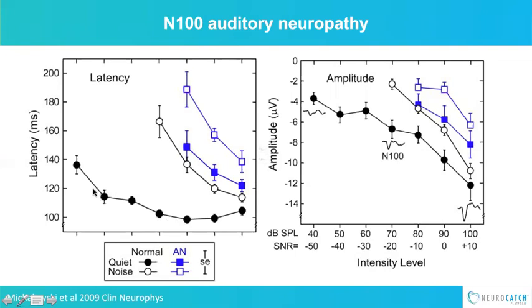If you go to a quieter tone, it slows to about 140 milliseconds. Now, if you add background noise, you can see that even in healthy individuals with no hearing problems, that has a sharp effect. As you add noise, you slow the latency response down. And as you get into louder tones that overcome that noise, you can catch back up to optimal processing.